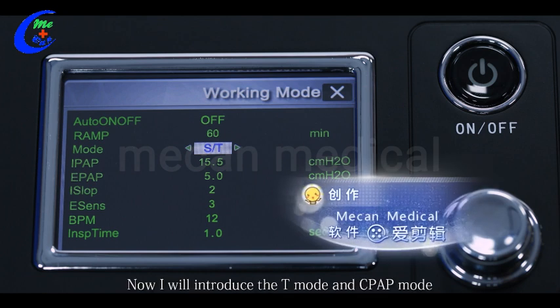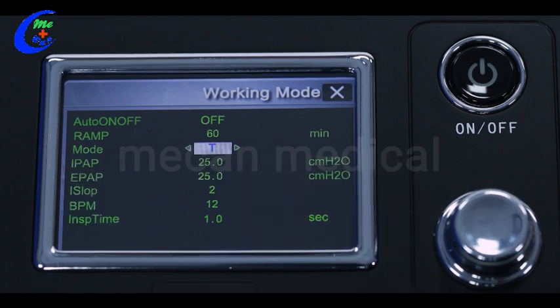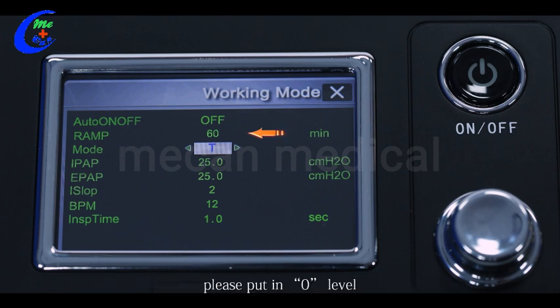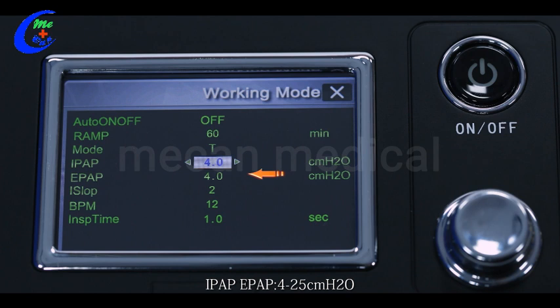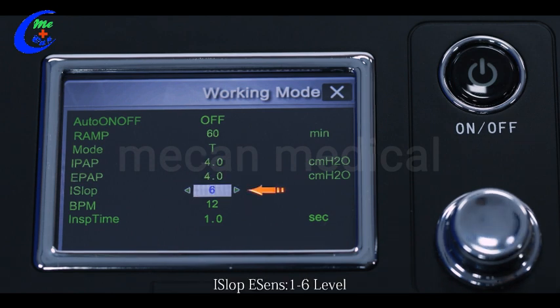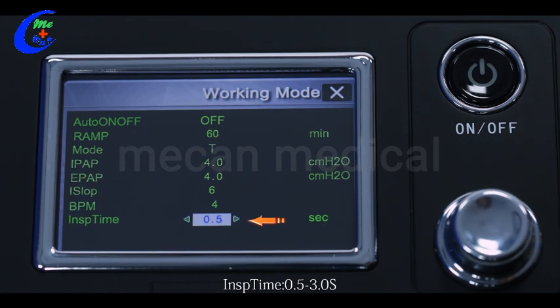I will now introduce T mode and CPAP mode; the other modes can refer to these two. In T mode you can see: Auto on/off; Ramp 0 to 60 minutes, set according to user requirements — if not needed, set to 0. IPAP and EPAP: 4 to 25 cmH2O — IPAP should be higher than EPAP. E-Sense 1 to 6 level — the smaller the value, the higher the sensitivity. BPM 4 to 40. Inspiration time 0.5 to 3.0 seconds.